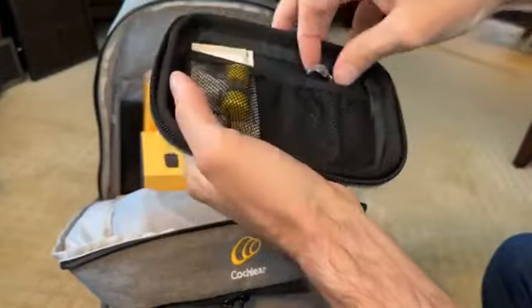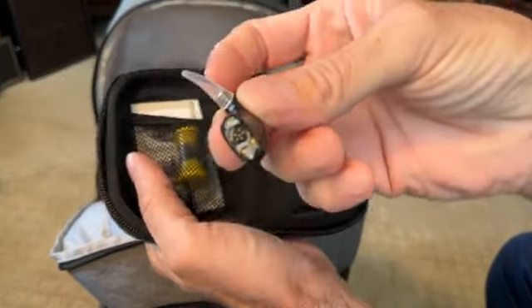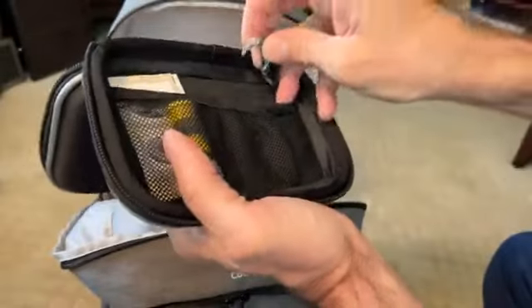Surprisingly, you get quite a few backups in case you lose things. There's the black one — another ear hook.